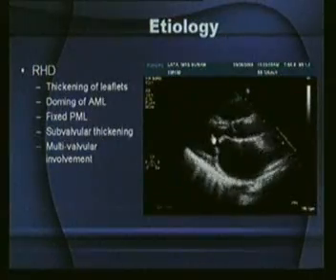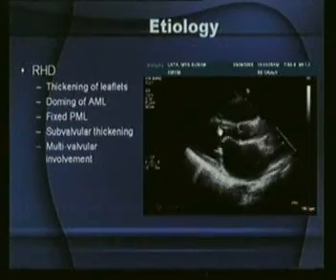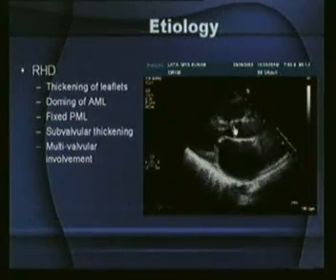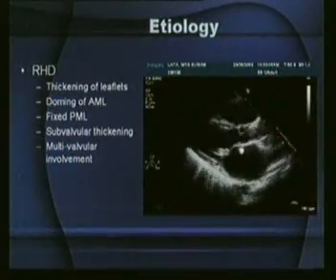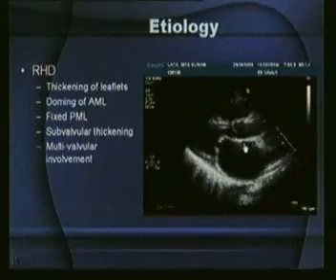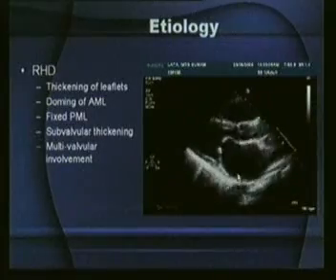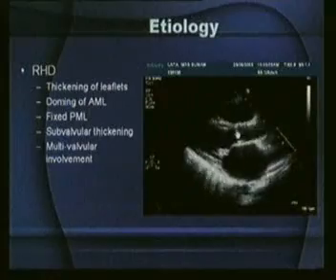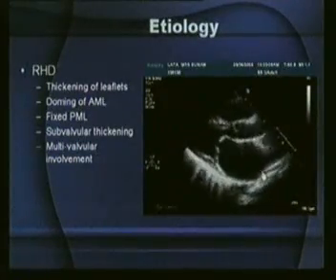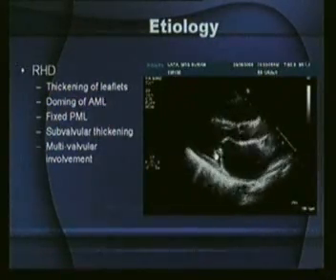Now you can see very clearly here that you are seeing the anterior septum, as we discussed last time. You are seeing the aortic root, and you are also seeing the aortic valve fluttering inside. Below the aortic root, behind it in fact, you are seeing a chamber which you know is the left atrium, and it appears enlarged because even roughly you know that this is the aortic root. It seems larger than the aortic root, and you are seeing two mitral valve leaflets: the anterior mitral leaflet and the posterior mitral leaflet.